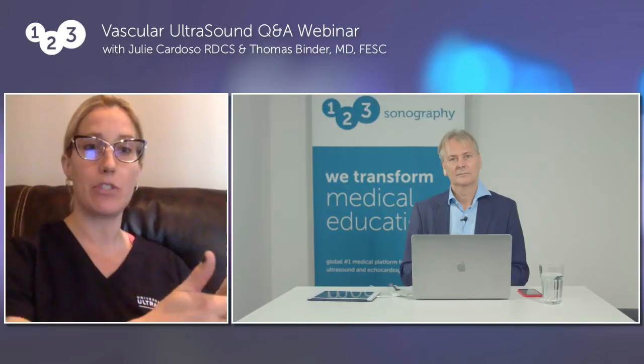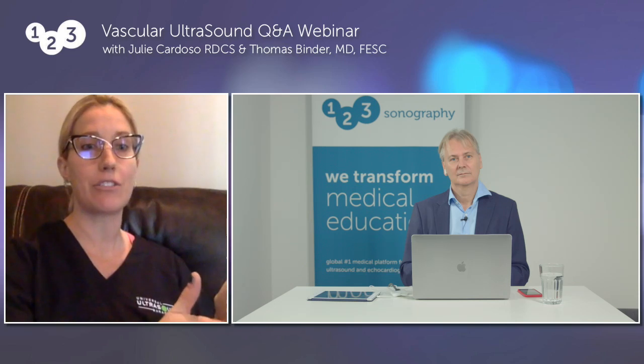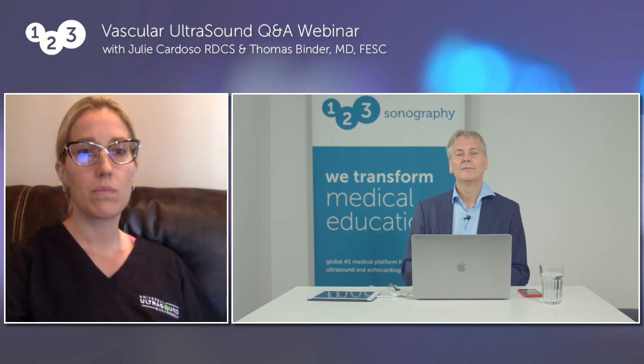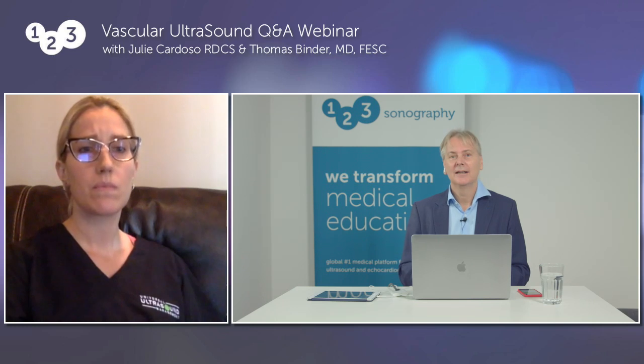So usually if there's an occlusion in the proximal mid portion of the SFA, we will see revascularization in the distal region of the SFA through the deep femoral artery in the Hunter canal region by the above knee popliteal artery. And you can see this with color flow. Okay, so a very important issue, you have to of course look at the collateral flow as well, and you have to know your anatomy.